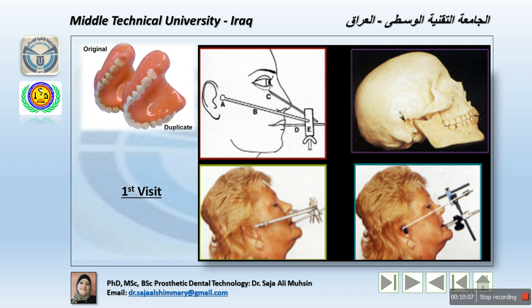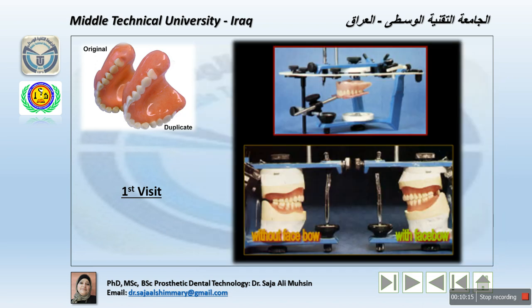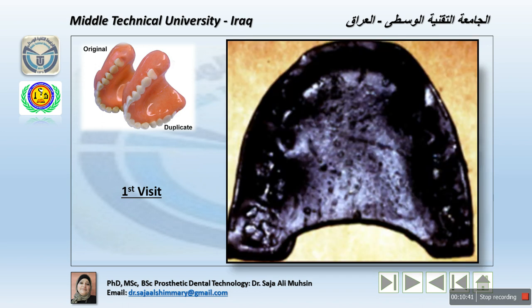The facebow record is taken as well at this point, to minimize the occlusal error that could be generated during the lab procedure by the dental technician. So all these should be checked by the dentist and agreed with the dental technician as well, and the occlusal relationship using the facebow should be checked too. We may need an intraoral record as well, to detect many issues, such as if we have some soft tissue to be removed or hard bony structures needing relief or surgery that may appear during the period of wearing the denture.